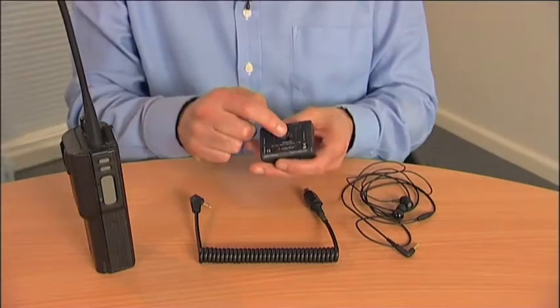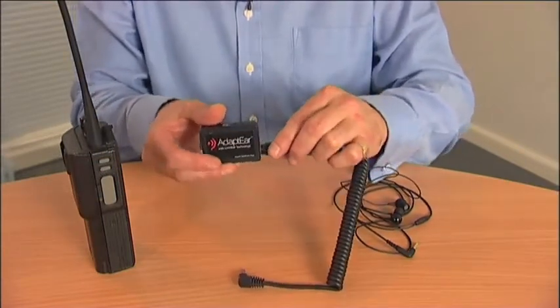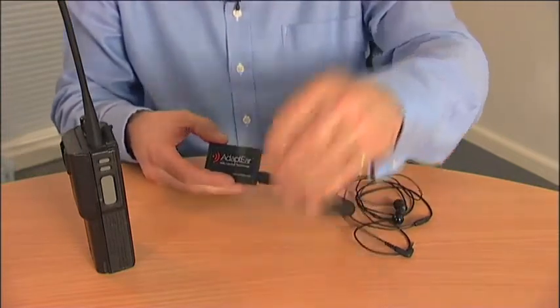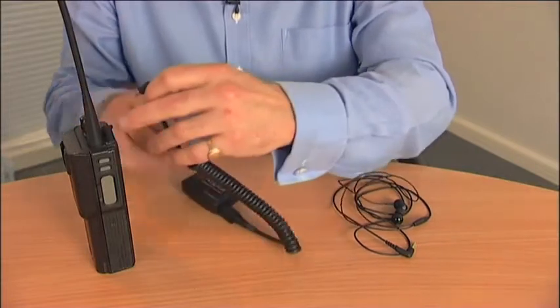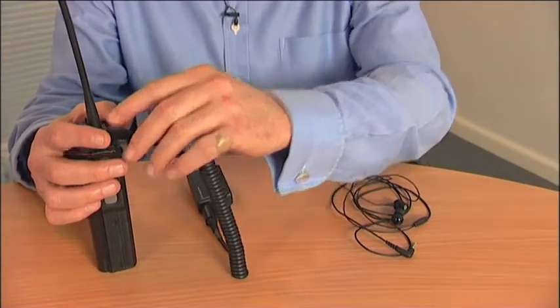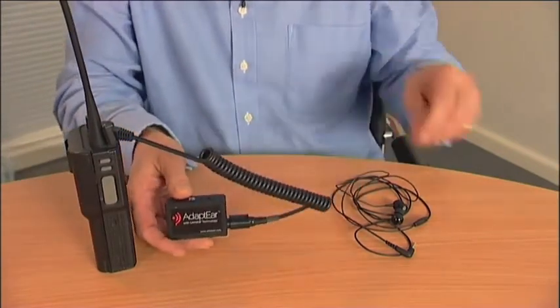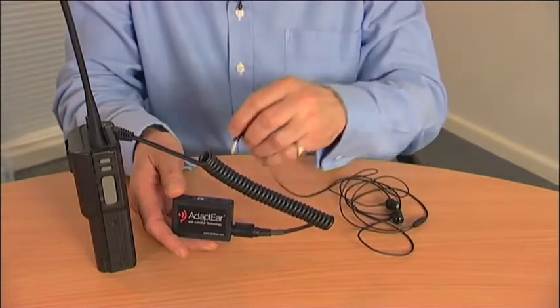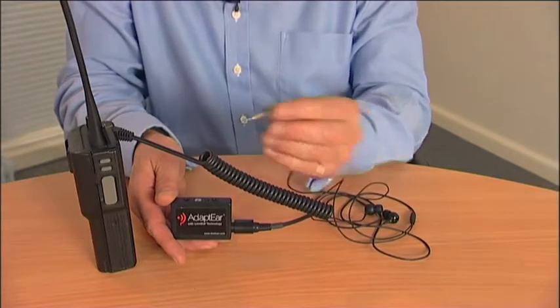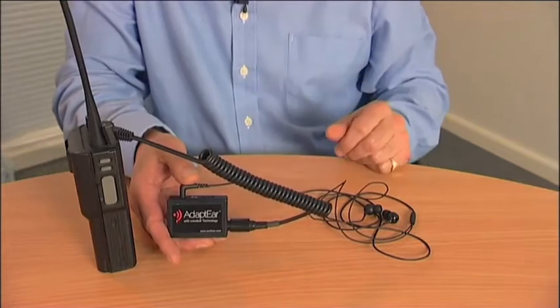Once you've set the Adapt Ear, take the MiniDIN plug and insert it into the MiniDIN socket, which is clearly marked on the side of the Adapt Ear unit. Once connected, take the 3.5mm listen-only jack and insert it into the listen-only socket of your private mobile radio. If your private mobile radio doesn't have a 3.5mm jack, please contact your dealer or refer to our website for other connector possibilities. Take the 3.5mm connector for your earpieces and insert it in the phone socket. You're now protected and ready to go.